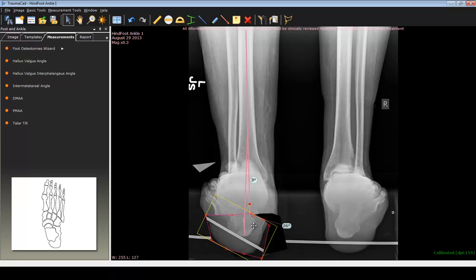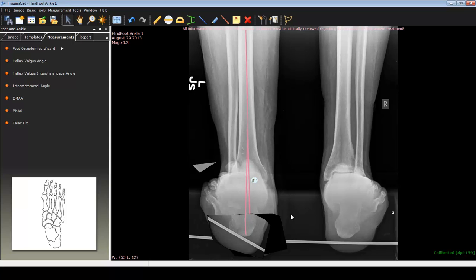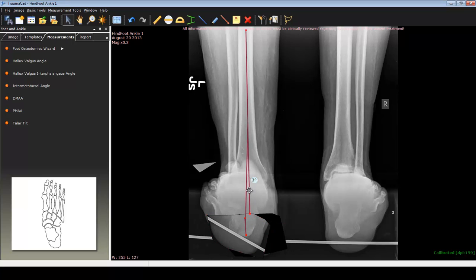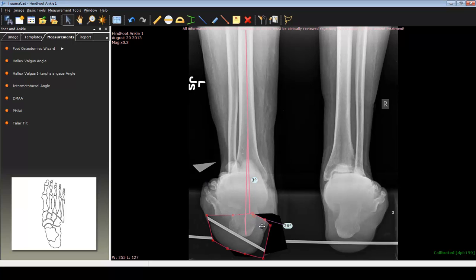We can address that by just translating the calcaneus laterally. Now we have a more normal appearing calcaneus that is rectus with respect to the tibia, with no more varus deformity and slight valgus. This can easily be taken to the operating room for preoperative planning, knowing that only a two centimeter wedge needs to be removed and the calcaneus needs to be translated laterally approximately two centimeters as well to get a more rectus position.